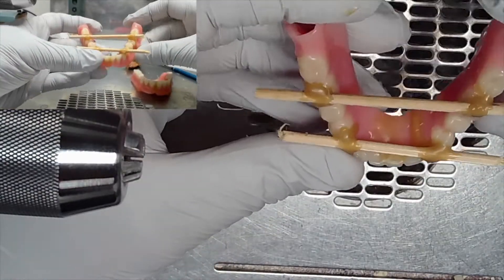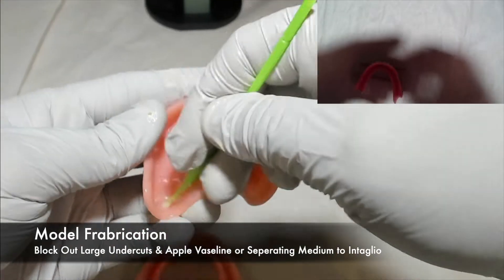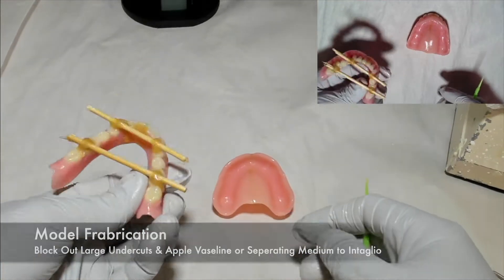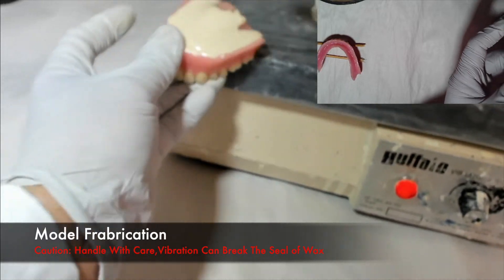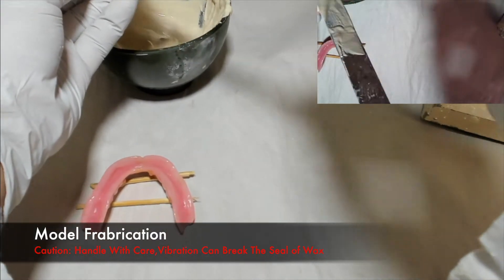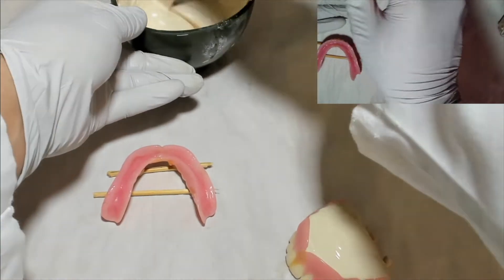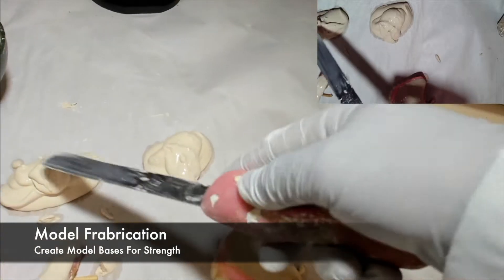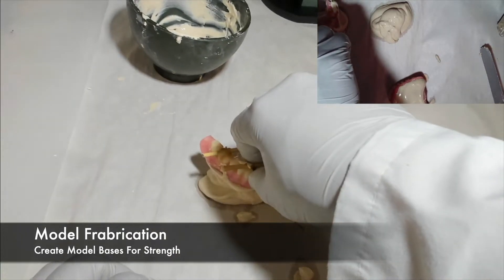When fabricating a model for a fracture repair, it is important to block out any large undercuts with wet paper towel or wet tissue. In dentures that don't have major undercuts on the intaglio surface, just be sure to place separating mediums such as Vaseline before pouring the model. Remember that these dentures are assembled with just sticky wax, so handle with care. Placing these dentures on a vibrator can break the seal of wax and you will need to reposition the denture pieces. Remember to create model bases for strength, as it is important that these models are strong in order to manipulate them during the repair procedures.